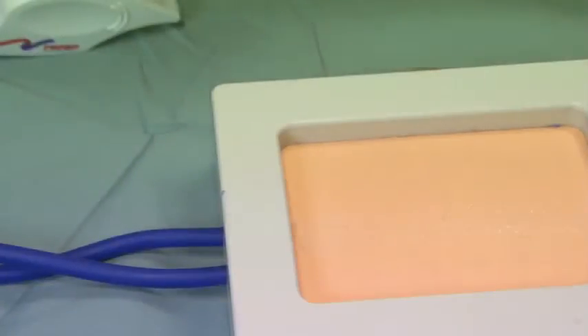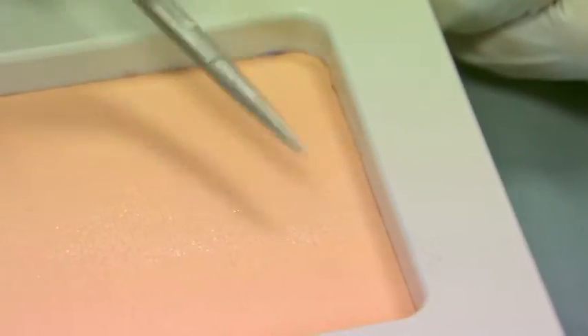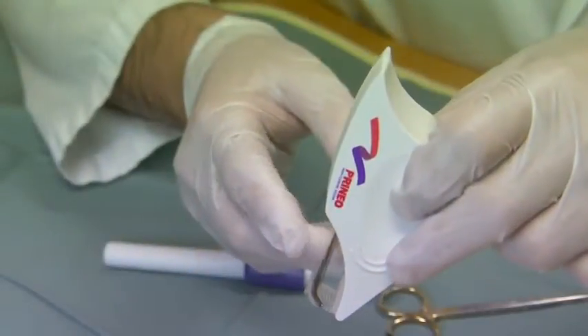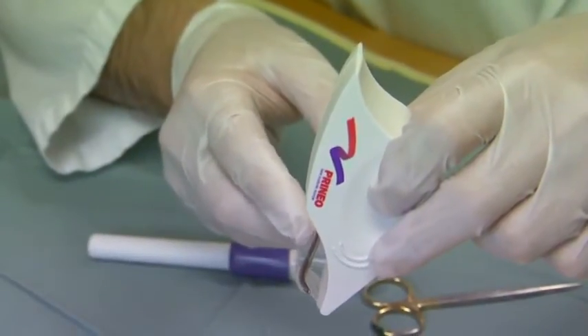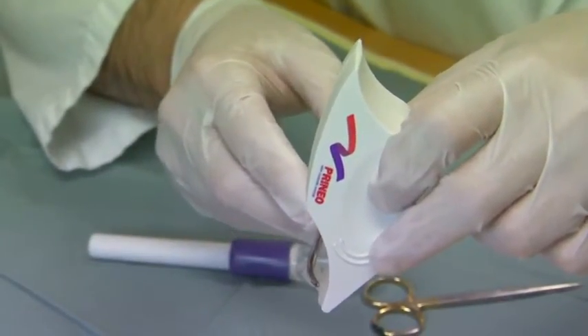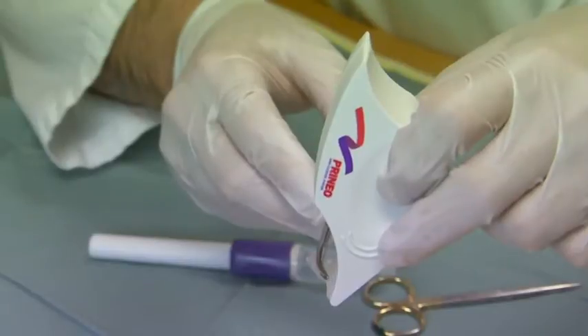Cut the other end of the leader. I want to smooth it down to each edge and make sure it's closely applied. I'll use the hemostat to grab the end of the polyester mesh — this is to minimize wastage and prevent the mesh from rolling back into the applicator.